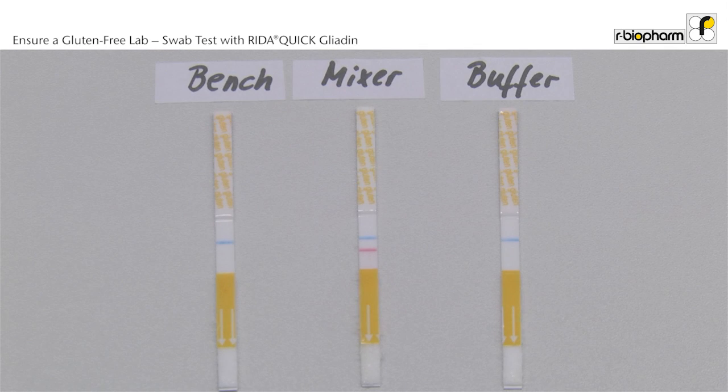The first dipstick is the swab from the lab bench. Only the blue control band is visible. This result is clearly negative.